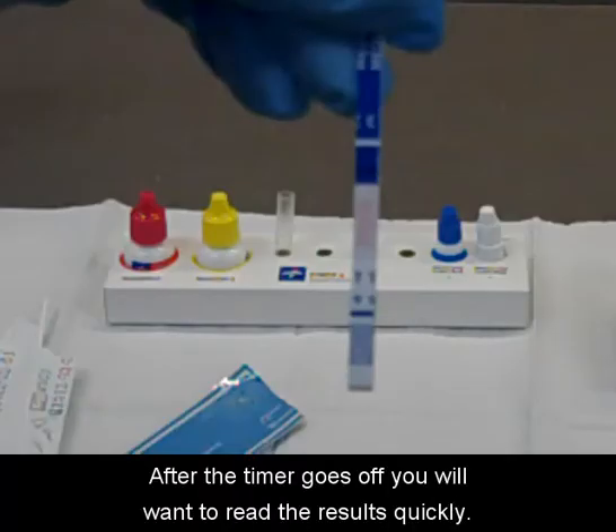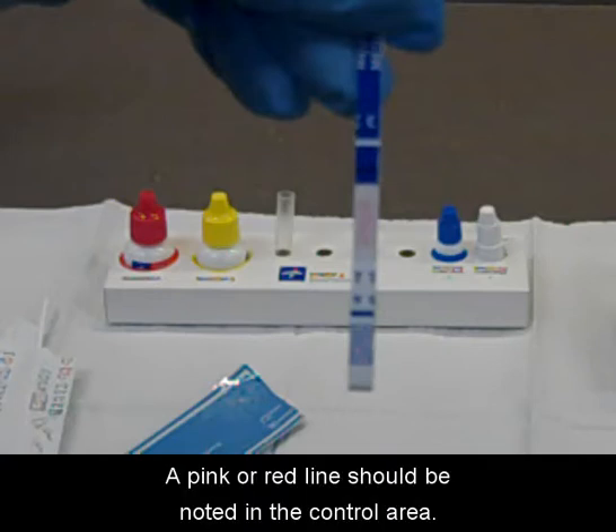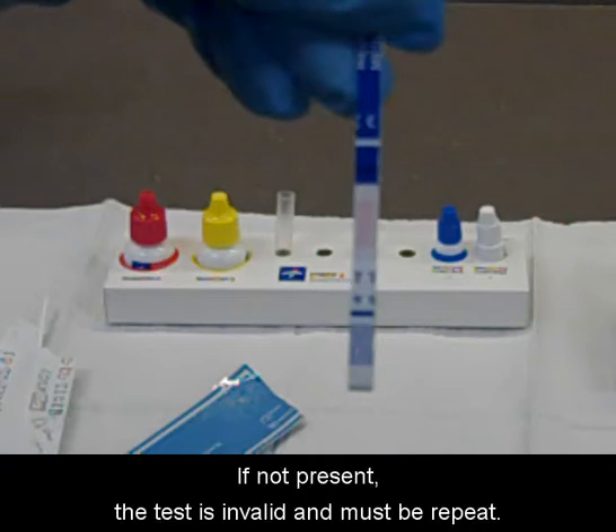After the timer goes off, you will want to read the results quickly. A pink or red line should be noted in the control area. If not present, the test is invalid and must be repeated.